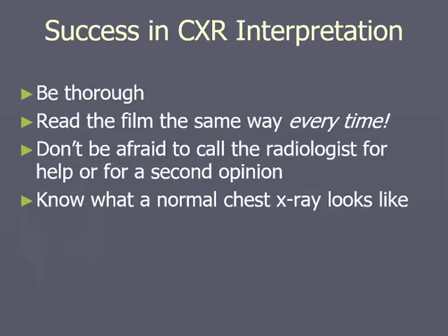The old saying is, you have to learn how to be good before you can be fast. Don't try to be fast before you're good. You have to get the basics down, and then as you do it more and more, you will get much better. The way you practice this is on any chest x-ray report you get, you can also look at the film.